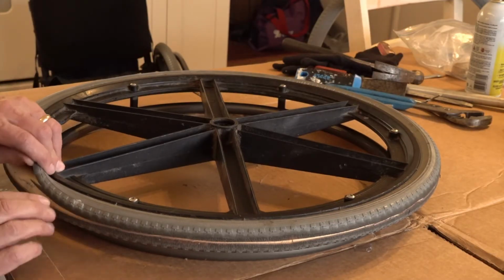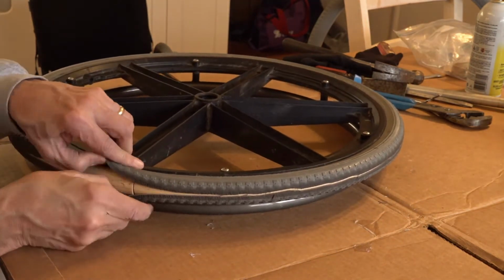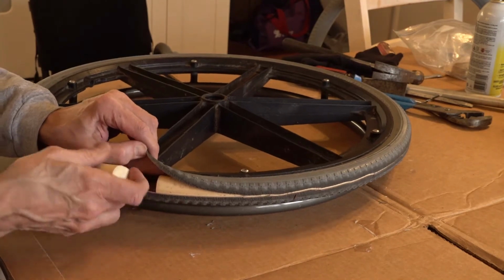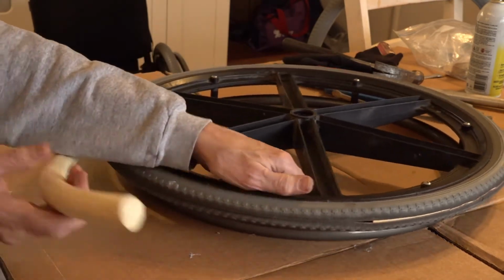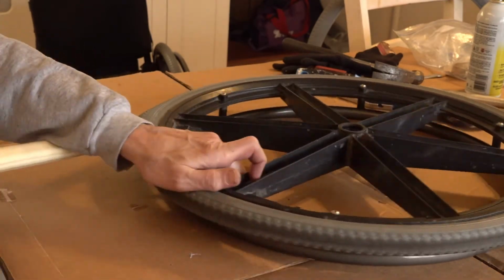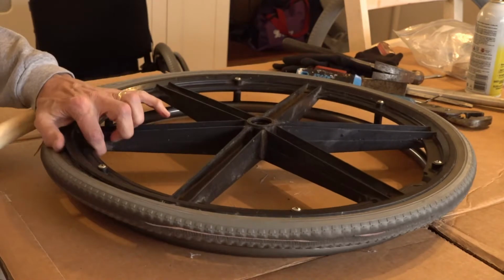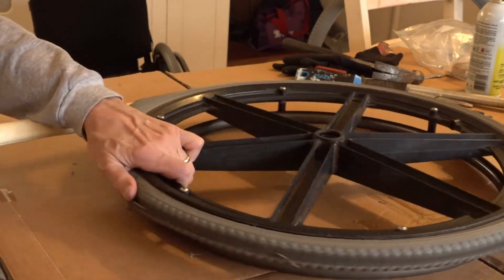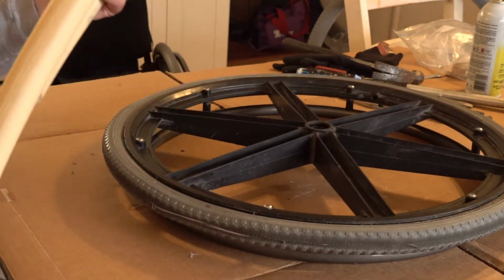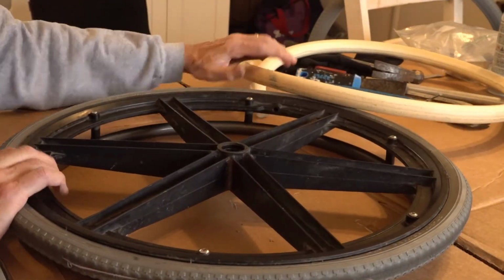Okay, the next thing to do is to take out the insert. Find where it's spliced together right here. So here we go. Just taking that out. And so here's the insert from the tire. We're going to save that and use that on the new one.